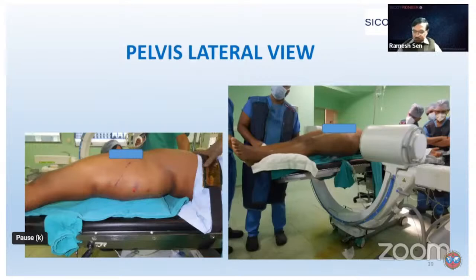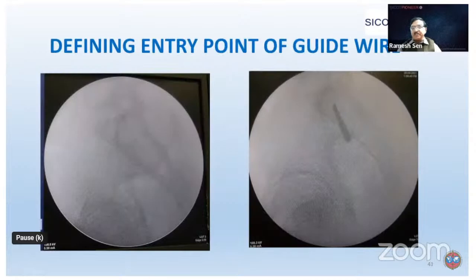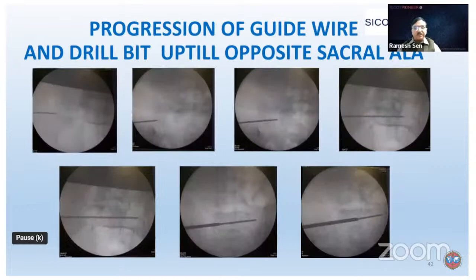In the lateral view, once the patient has been properly placed with a little elevation in that area, we look at the sacrum, trying to define the cortical density over here, and avoiding this area because here we are likely to be out. So our area will lie somewhere just below the cortical density, and there we pick up a point of entry. This is the entry point. We widen it a bit and thereafter put our guide wire over there, and then we come over to the inlet and outlet view. So gradually going from inlet to outlet, we get the transmission of our wire across towards the opposite side. And once it is done, we can put a screw.